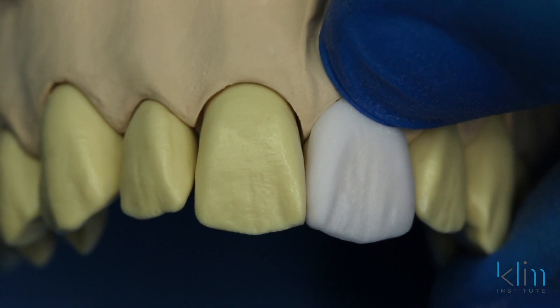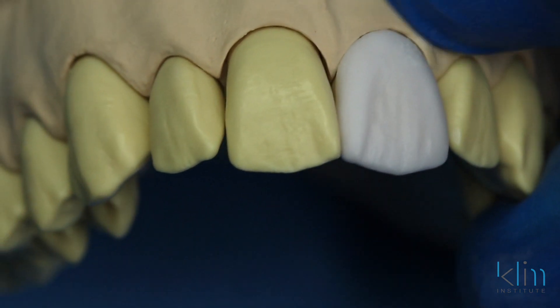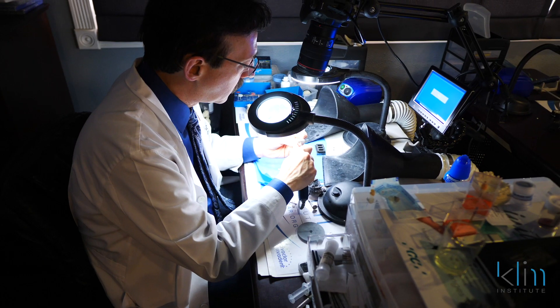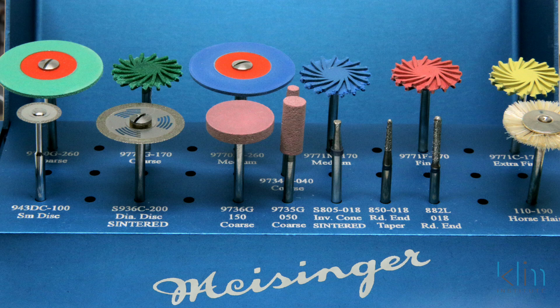The next step is to start the anatomy protocol — primary grooves. It's good to understand what primary grooves are, particularly if you're doing one restoration. Primary grooves are depressions in the labial surface; on centrals there's usually two. However, they're like a fingerprint — they're different for everybody, but the principles are still the same. The technique is global shaping first. In the software we can get most of the shaping we need, but I like a little extra ceramic so I have room to shape. My best milling unit is these two hands with the right burrs and the right system. The JK-03 Burr Lab Kit provides those great burrs.